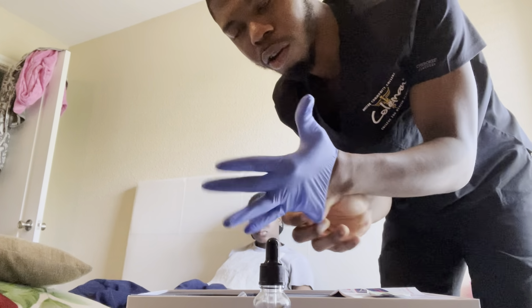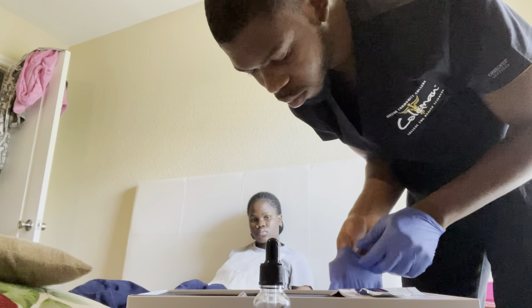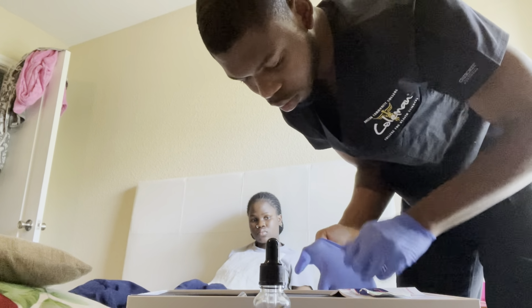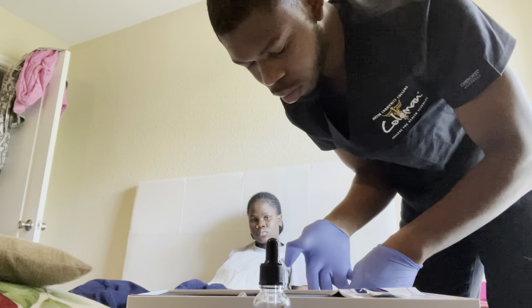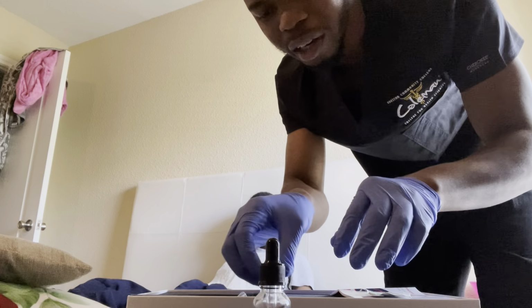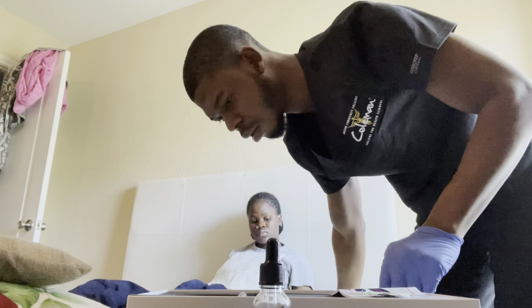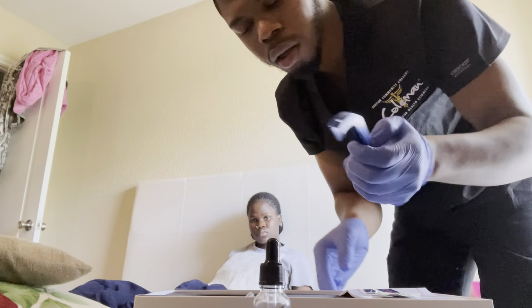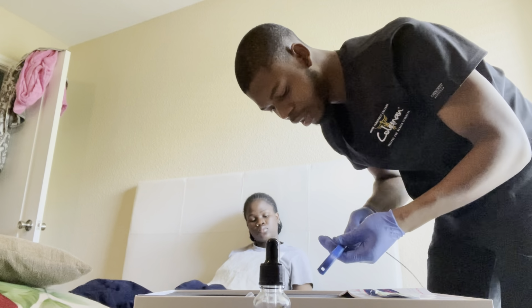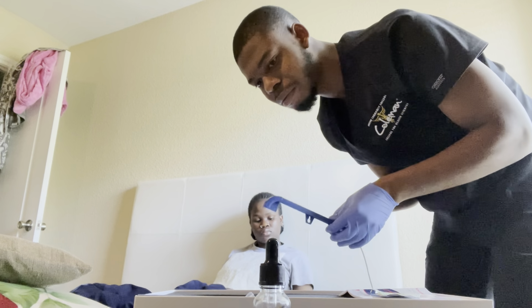I will put on the sterile glove that I got from the suctioning kit. After I'm done with that, I will carefully take the one-time use catheter, and I will connect the other end of the suctioning tubing to the end of the catheter.